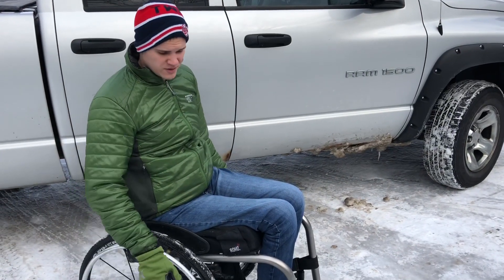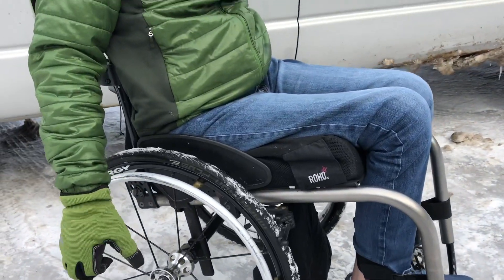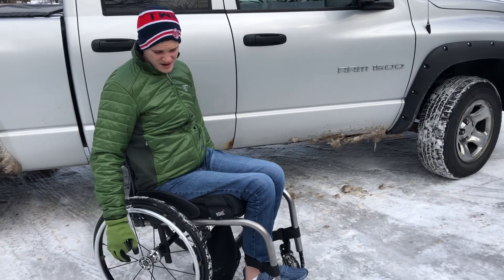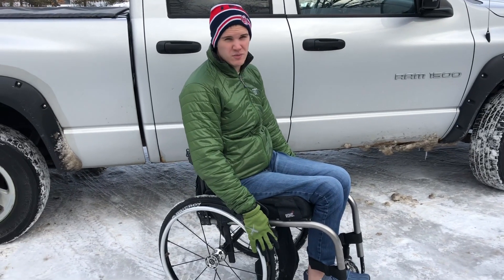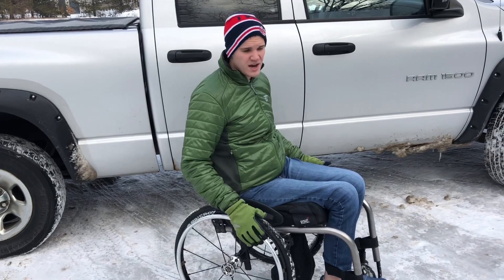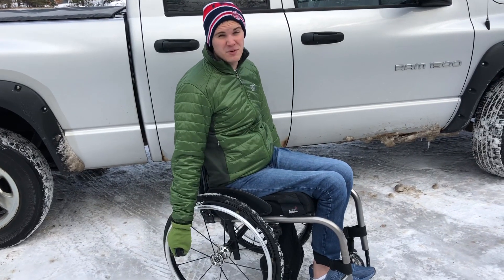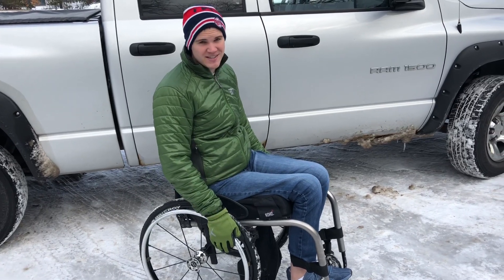Now we're gonna transfer into my dad's truck. A key factor in transferring is making sure your brakes work well, especially if it's your first time. Having the right amount of air in your tires helps your brakes work so you can rely on your chair — it's not gonna go flying. If you have your hand on your chair and it moves, you're probably gonna move too, so make sure to use your brakes when doing your transfers.